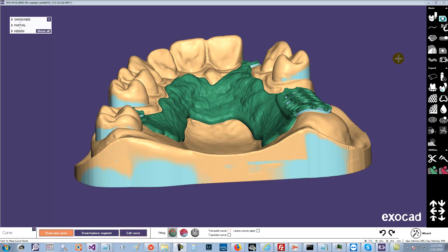In Expert Mode, Curve Tool, Turn Off Fitting, Turn On T-Junction, and we'll just make a simple support bar setup like this.